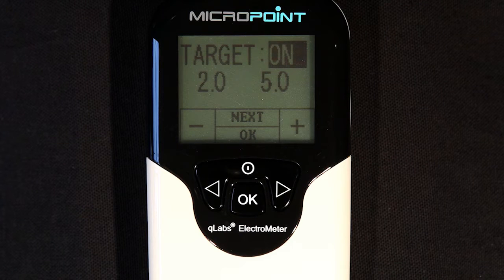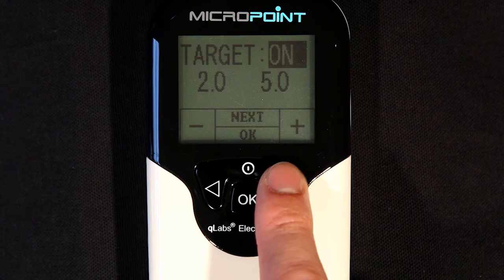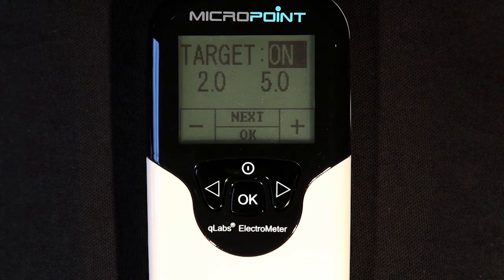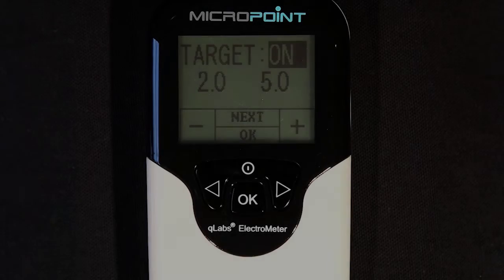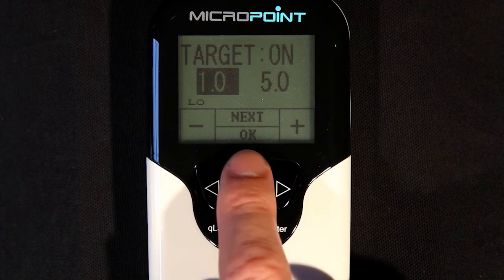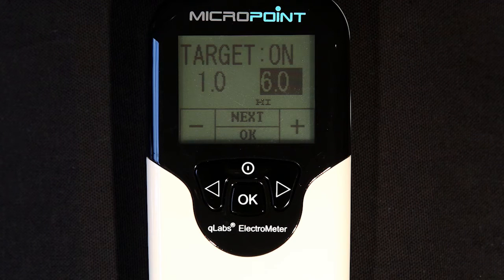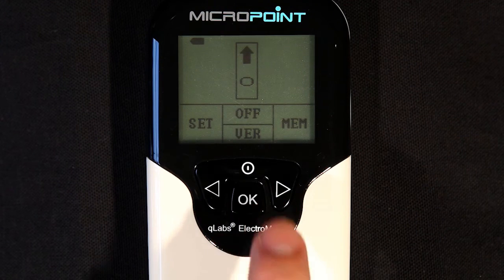The target range feature is used to alert the user when the INR results are out of range. To activate or disable this feature, highlight the target field and use the plus and minus or right and left buttons to switch between on or off. If the power supply to the Electrometer is disconnected or if the batteries run out, the date, time, and target range settings will be lost and will need to be re-entered. Press the next button to highlight the next field and change the lower INR limit to the desired settings. Press the next button again to change the higher INR limit. When all settings are acceptable, press the OK button to confirm.